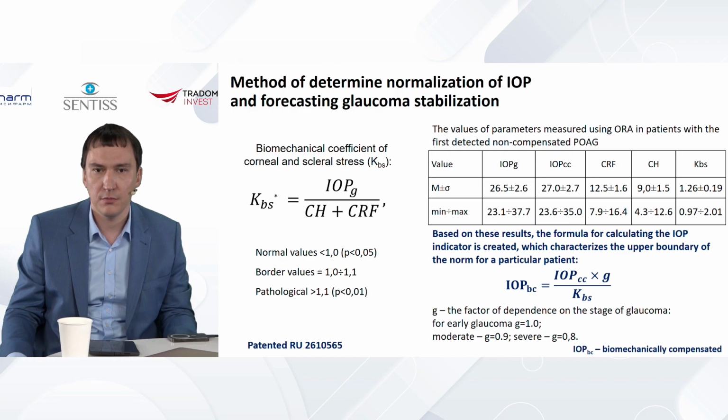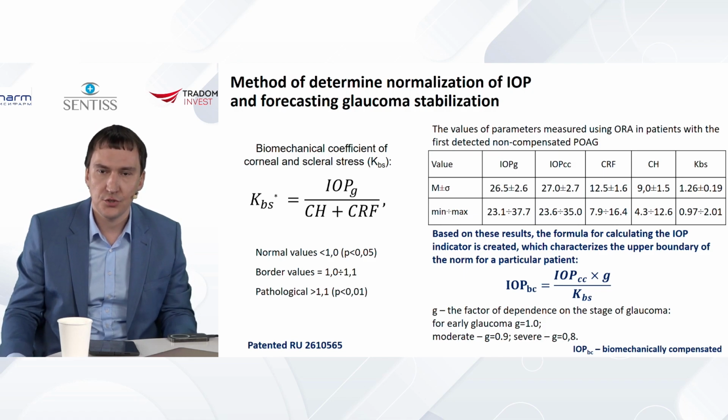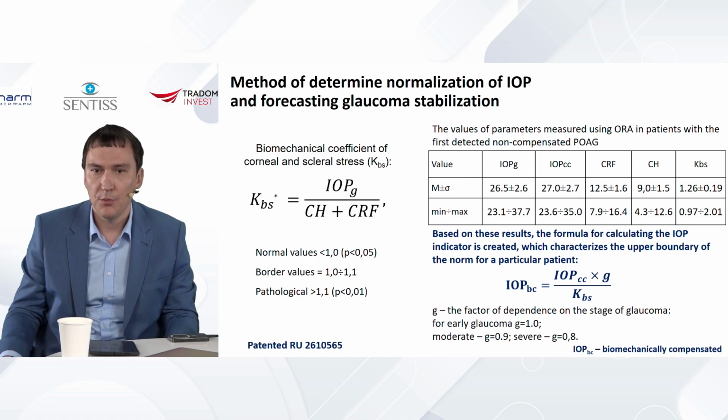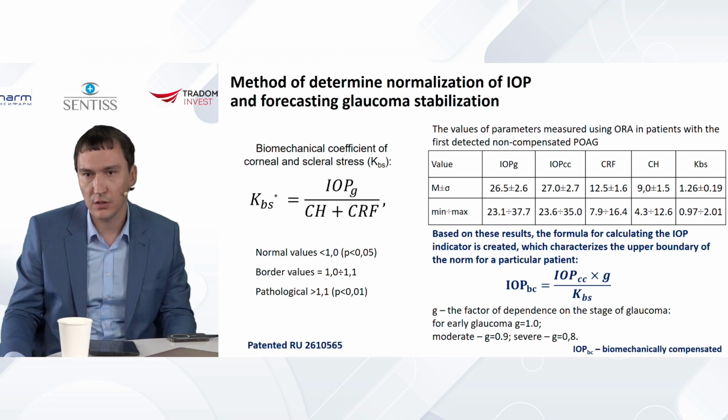And from our side, we are looking for opportunities to carry out similar analysis, and we believe that a biomechanical, contactless study using the ocular response analyzer gives us enough data to get a particular level of biomechanical compensation of intraocular pressure that later on could be used clinically.